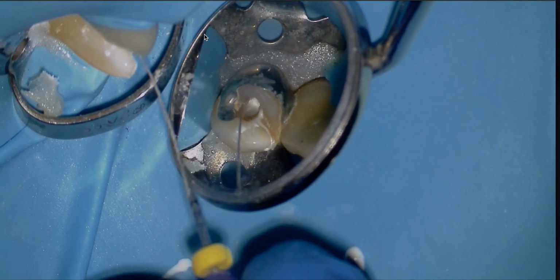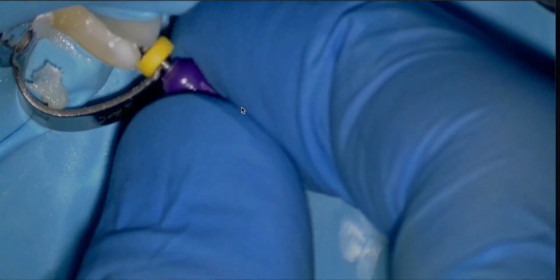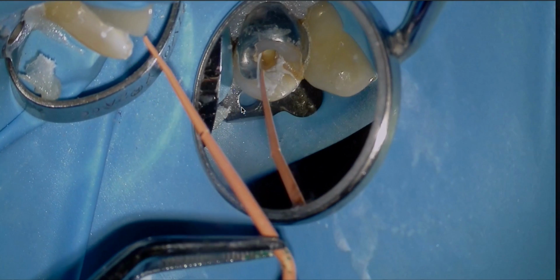So before we put our gutta perchas in, when you place your BC sealer in here, there's going to be an air bubble underneath this BC sealer. So what I've found is I'm going to take a number 10 file to length. I'm going to burst that air bubble because sometimes I find it's just enough to keep my cone from seating all the way down. And then I'm going to place, this is going into the palatal canal.